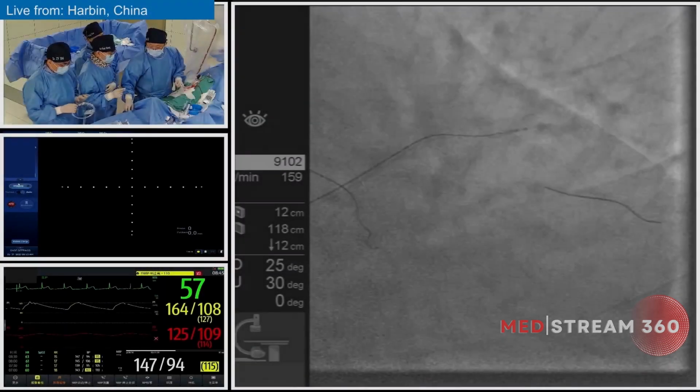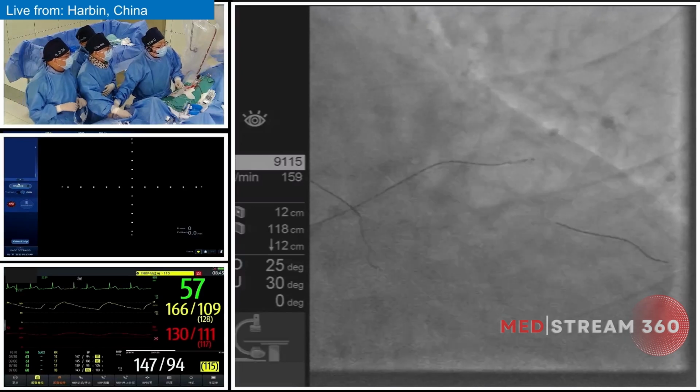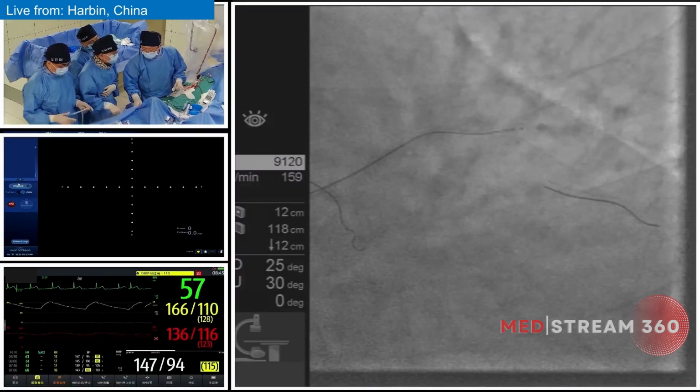So, Professor Lee, do you think the calcification within the CTO segment is an issue for this puncture difficulty?